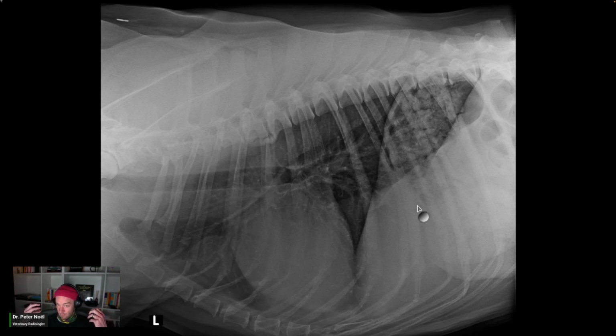So if you have an acute accumulation of pericardial effusion, and I'm kind of going on a tangent here, there was a study done out of Montreal that said that the globoid shape that we always classically think is related to pericardial effusion is for patients that have a decent amount of fluid that's accumulated over a period of time. So if you have a relatively rapid accumulation of fluid, the cardiac silhouette won't give you that globoid shape because there hasn't been enough time for the pericardium to stretch.